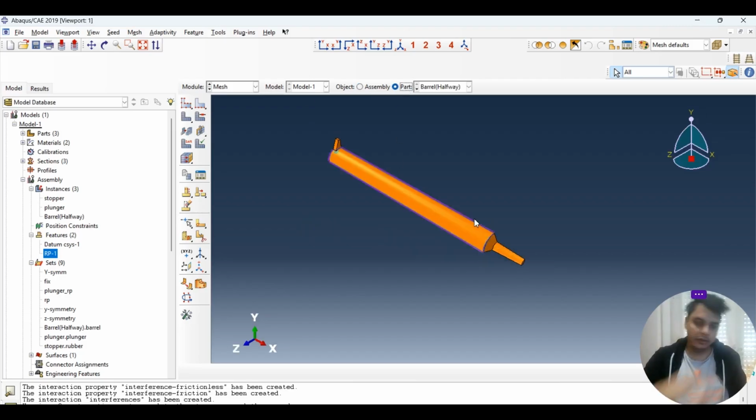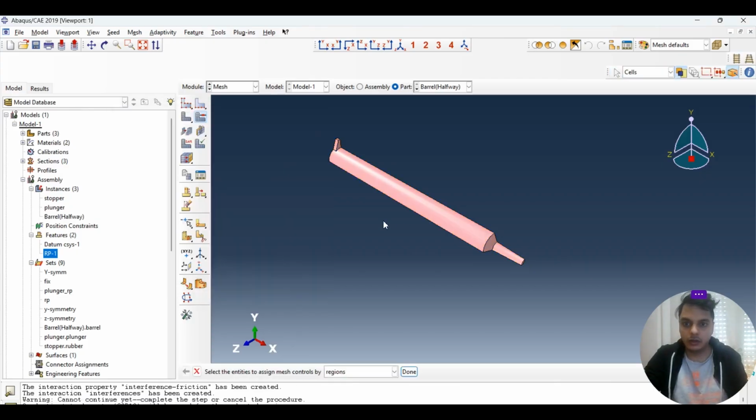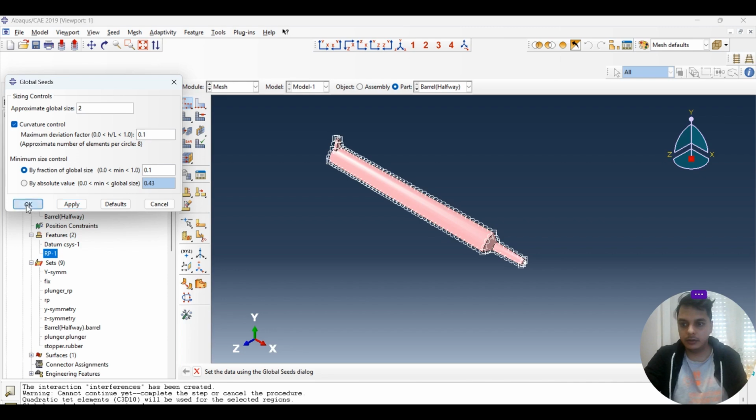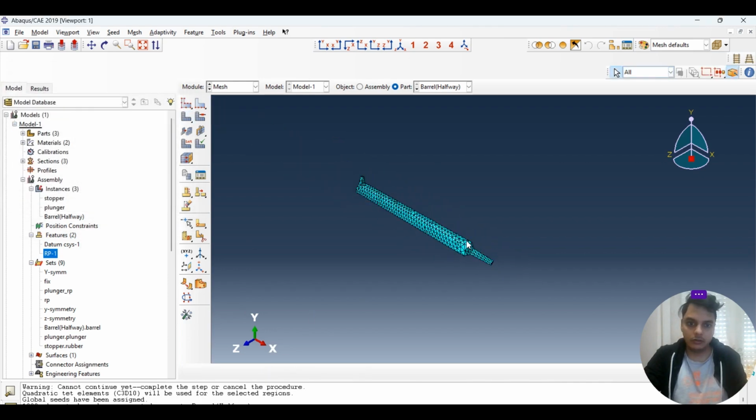Orange means we cannot define it with the hex mesh. So right now I'm not going too deep since our video is going to be long. I only want to define the tetra mesh here. So for that, we define it here. We said okay, we are all okay with tetra, and we want 2 mm. We apply it here. Say yes, and well, fine. So this is all okay.